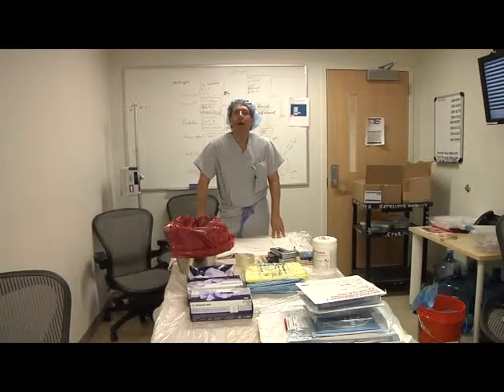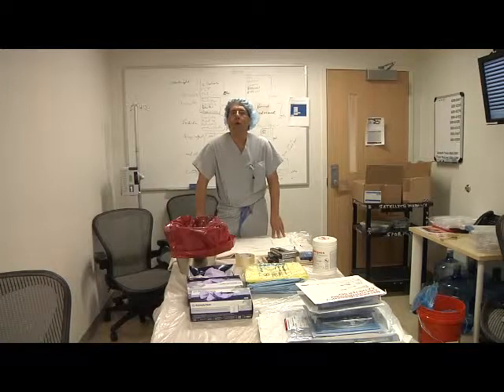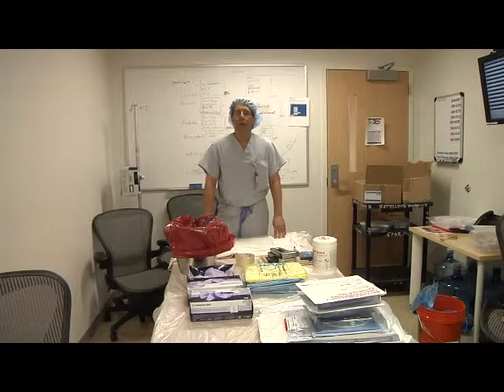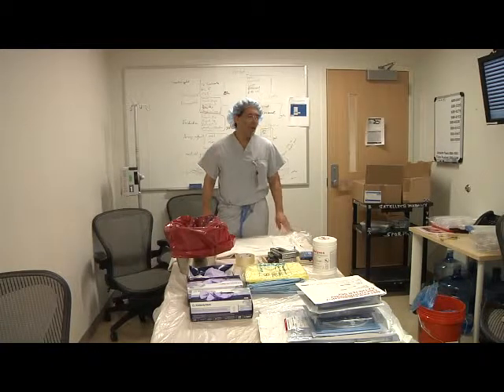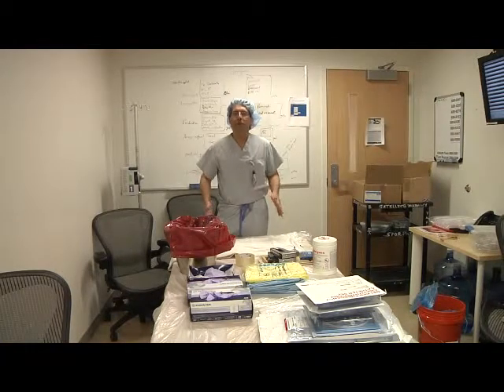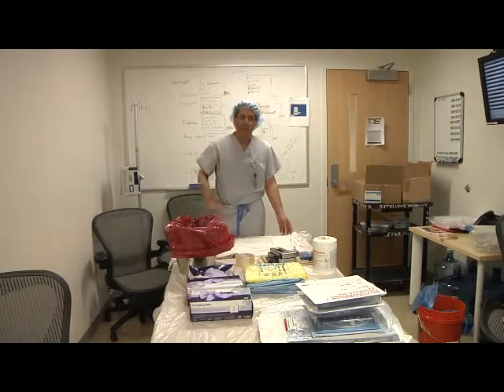This morning we're going to talk about the preparation for the swine trachea laboratory. These are some of the supplies that you might want available for your laboratory. First of all, we have a surface table that's covered with plastic. This happens to be our break and lunch room here at the hospital, so I've covered it with plastic.